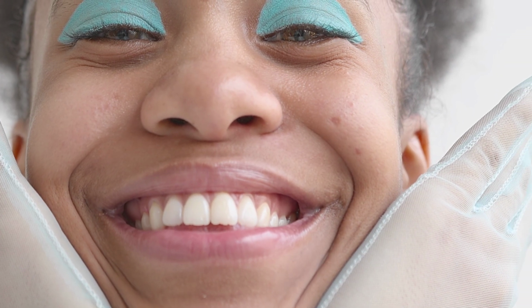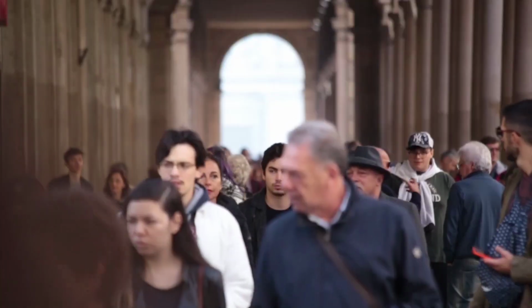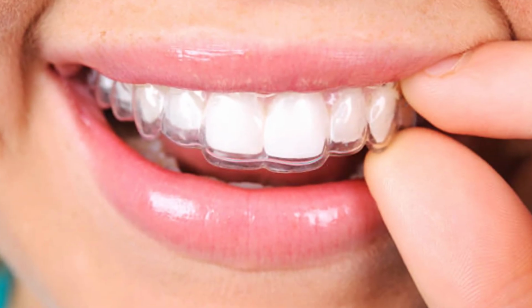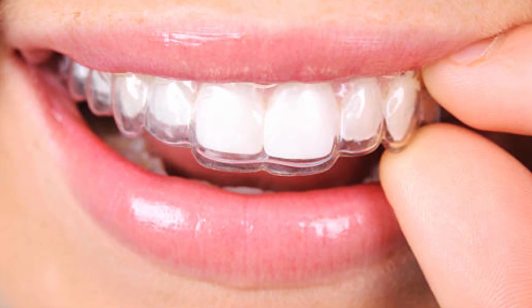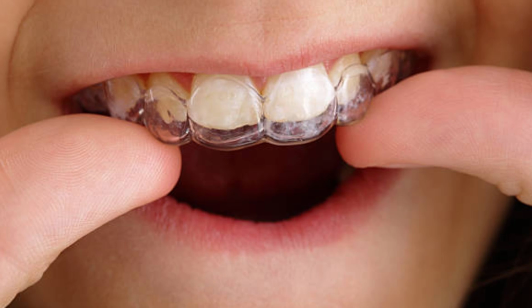Everyone wants a great smile, so the demand for aesthetic treatment is increasing day by day. More people are seeking alternatives to fixed orthodontic appliances. For these people, clear aligners, which are also called invisible aligners, are an aesthetic and comfortable option for orthodontic therapy. Clear aligners are transparent trays made of special material which are used to straighten teeth just like braces.